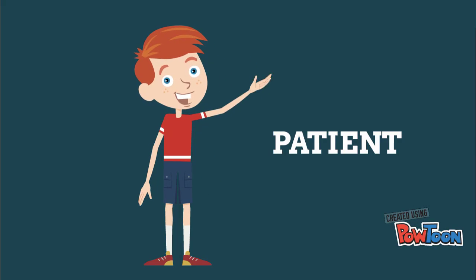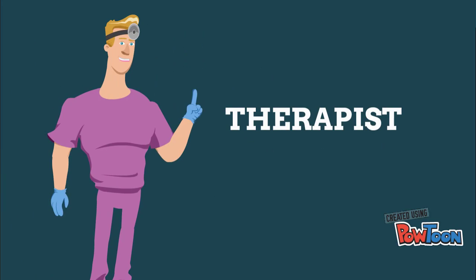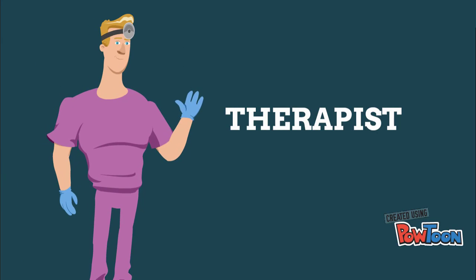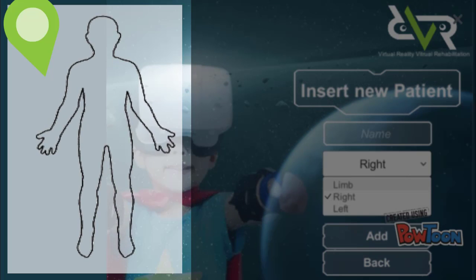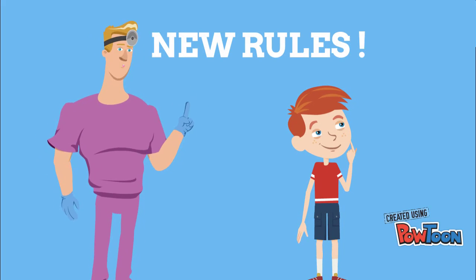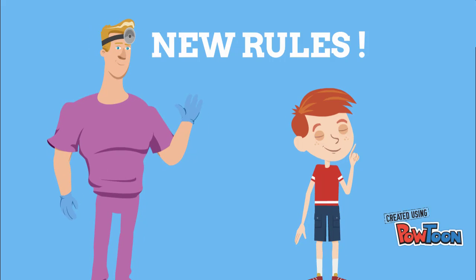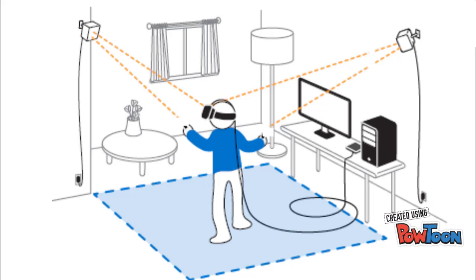The patient will obviously use his healthy good hand to interact in the game. So, in order to motivate the patient to use his weaker hand, the therapist changes the active body segments parameter. So basically, the therapist chooses the active hand to be tracked by the Kinect from the patient's settings. So, now the right hand is the only active hand in the game. So, now the therapist should explain the new rules to the patient, and the patient should only try to move his right hand.